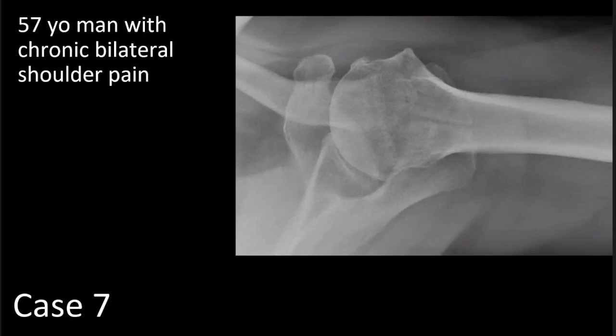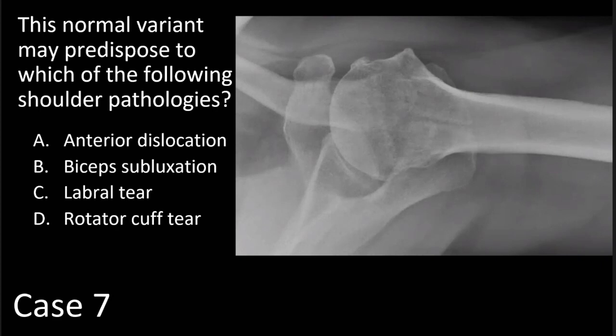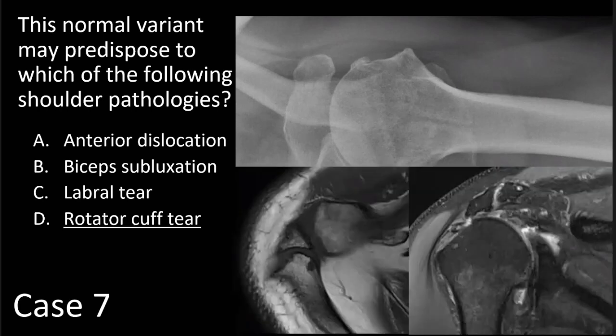Our next case is a 57-year-old man with chronic bilateral shoulder pain. On this axillary view of the left shoulder, we see a well-demarcated lucent line through the distal acromion with well-corticated margins on each side, as indicated by these arrows. This normal variant may predispose to which of the following shoulder pathologies? Anterior dislocation, bicep subluxation, labral tear, or rotator cuff tear? Although this is a little controversial in the literature, the correct answer is rotator cuff tear.